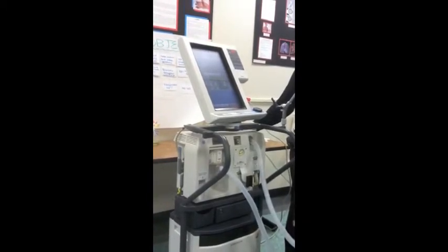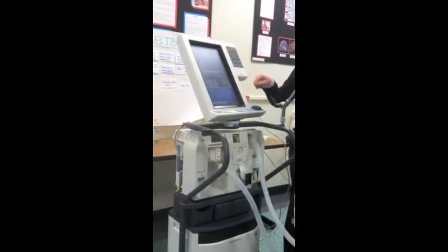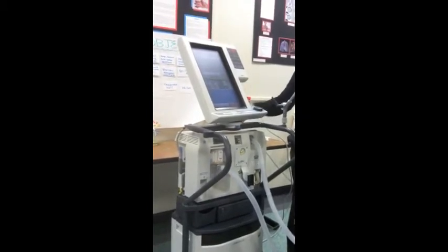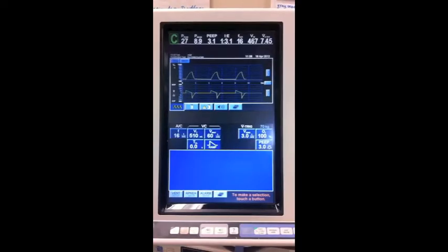When we talk about asthmatics and COPDers and all that, we'll talk about the fact that those patients definitely need longer E times, and the flows will usually be higher on those patients. So flows sometimes of 80 to 100. Get the breath in real quick so we can give them as long a time to exhale as possible.